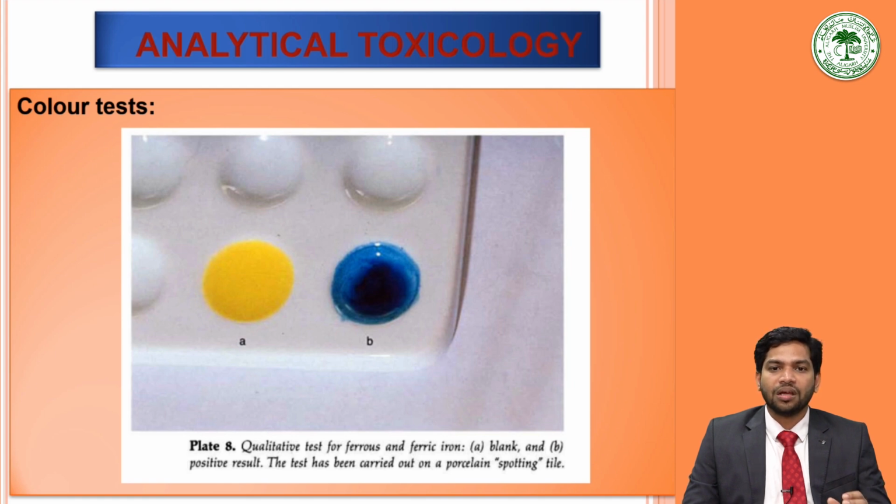compound. The qualitative test can be used to differentiate between ferrous and ferric iron and other metals, while the quantitative assay can be used to measure the serum iron. It is important to avoid contamination when collecting blood for measurement of the serum iron concentration. Vigorous discharge of the sample through the syringe needle can cause sufficient hemolysis to invalidate the assay. That can cause a spuriously raised level of iron.